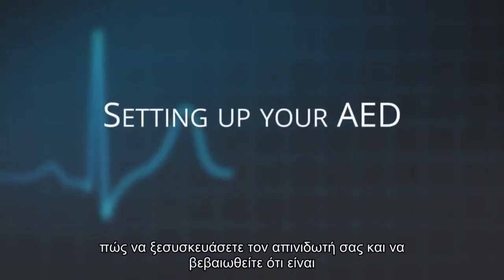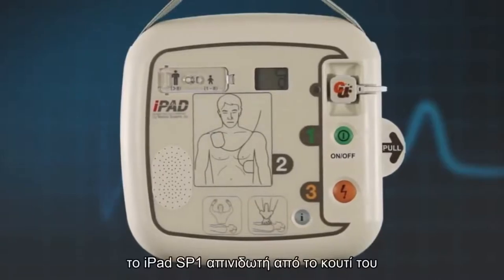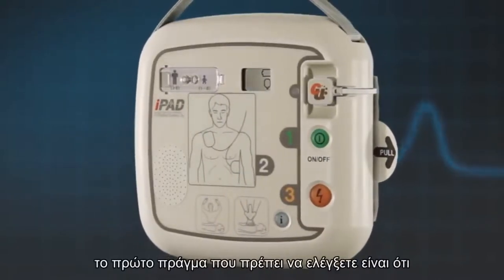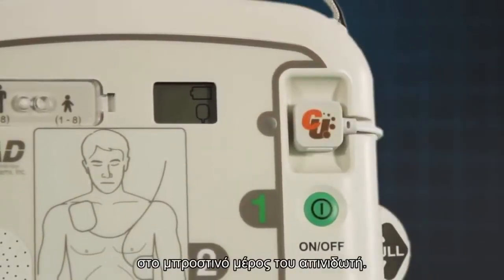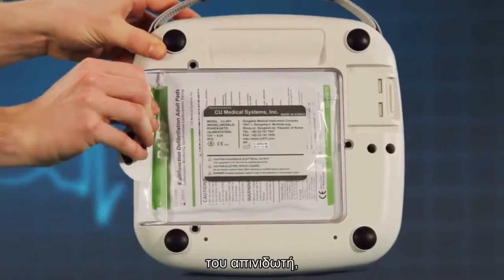This section will show you how to unpack your AED and ensure it is ready for use. After you have removed your iPad SP1 AED out of its box, the first thing to check is that the electrode pad lead is pre-connected to the front of the AED and the electrode pads are firmly in the pad storage compartment on the back of the AED.